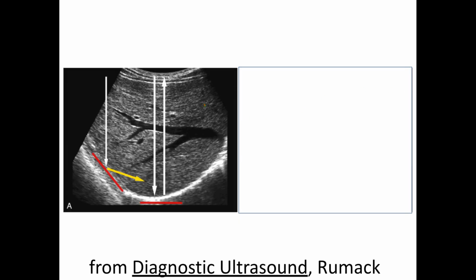We've got ultrasound traveling down through the liver, hitting the diaphragm, and note how perpendicular the probe is at this point to the diaphragm, so you get a nice bright signal. Whereas here, when the ultrasound is coming down and hitting the diaphragm obliquely, we get scattering or this oblique reflection where this information is not traveling back to the probe, so it's not interpreted as bright. Remember, the number of signals indicates how bright it is.